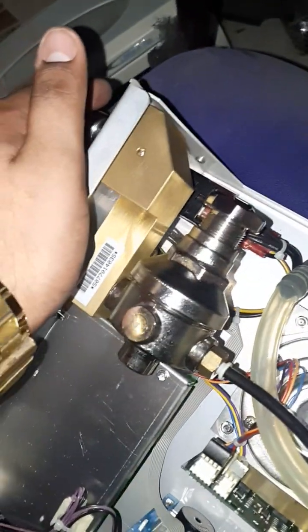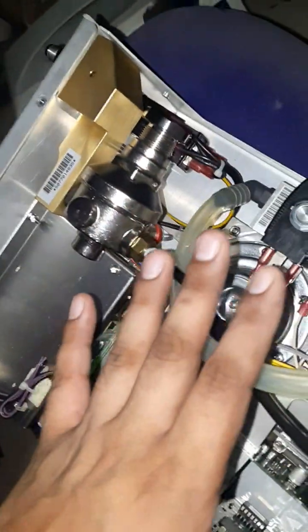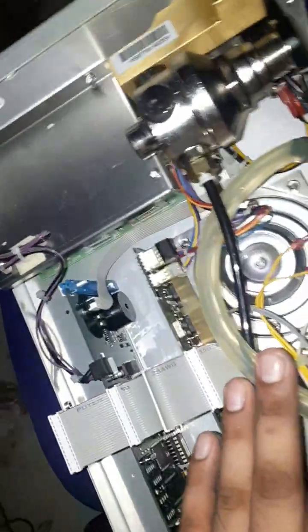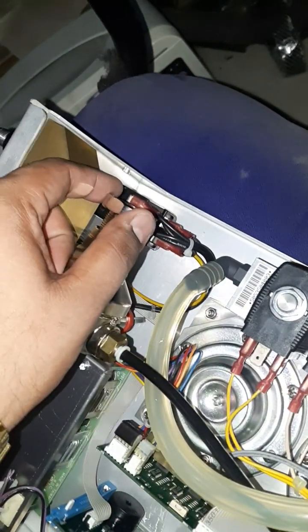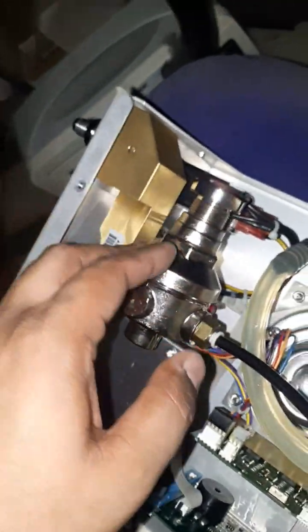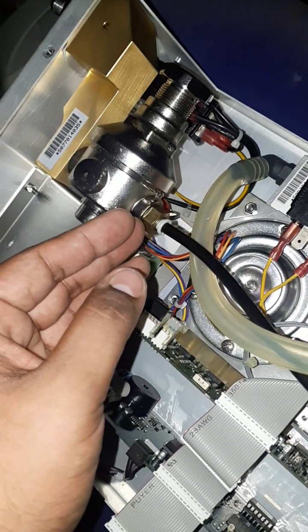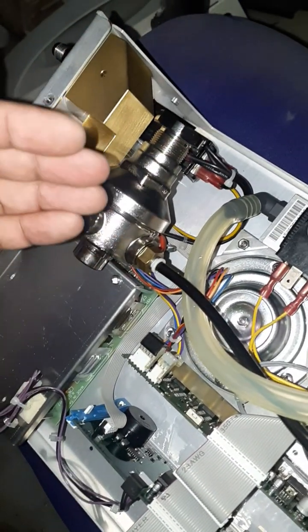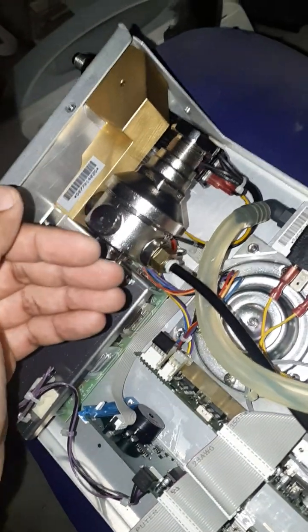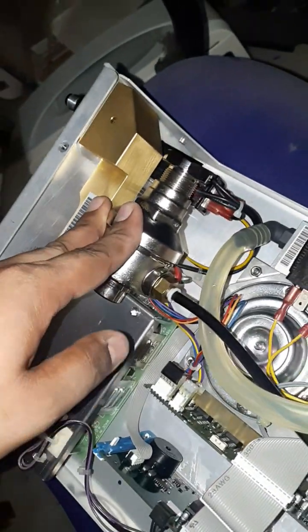After connecting this insuflator to the CO2 cylinder, you have to adjust this control knob. Sometimes this insuflator has one problem: the pressure is not coming out properly. It means there is some leakage inside this insuflator. So I have to rotate this knob anti-clockwise or clockwise accordingly. After that, how can you check whether the pressure is increased or not? You have to remove this connector, and by the volume of the flow of air coming outside from this nut, you can feel with your fingers, after rotating this knob, whether the air volume is decreased or increased. By rotating anti-clockwise first, and after that in the reverse direction the second time, you can get the high flow or low flow.